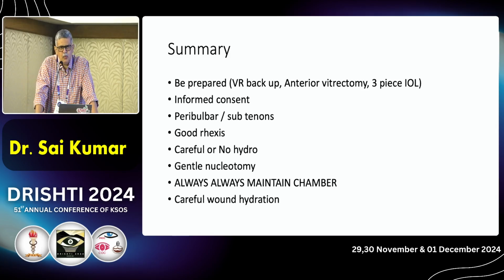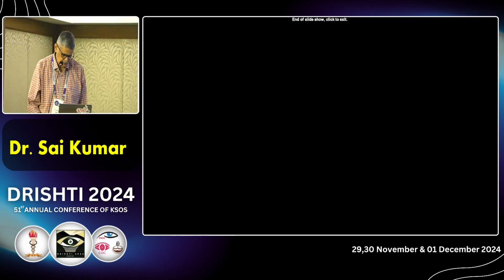Normally once we put in the intraocular lens, we feel okay, the lens has gone in, now nothing is there to happen. So even with the wound hydration, you have to be very, very careful and make sure you don't hydrate the wound or make the chamber very, very tight. So these are some PPC with PC rent experiences I thought I'd share with you. Thank you for your kind attention.